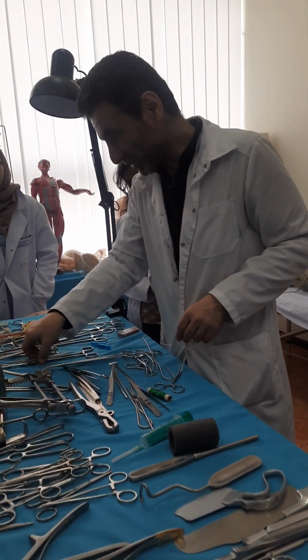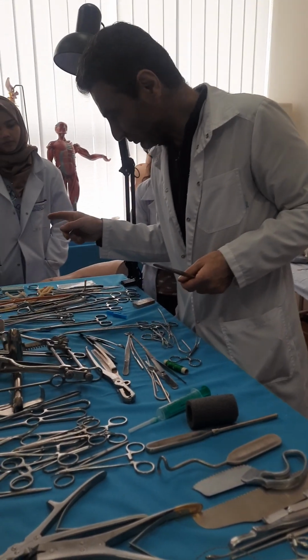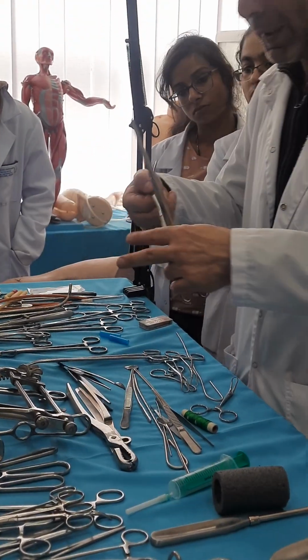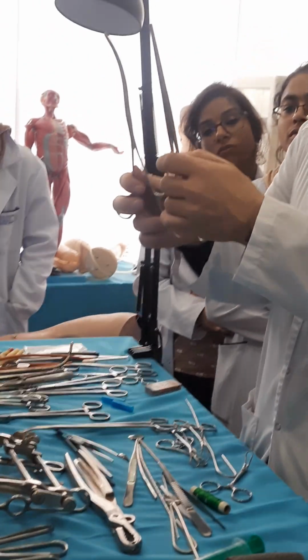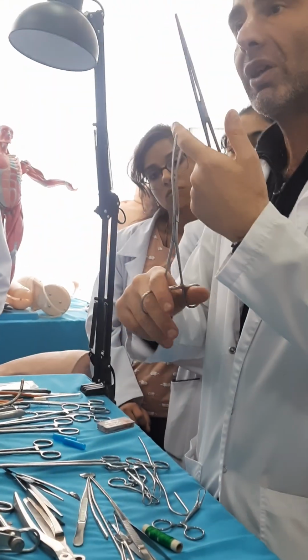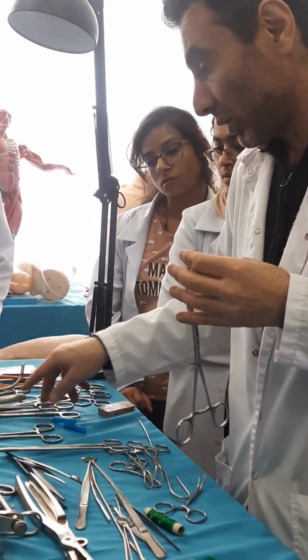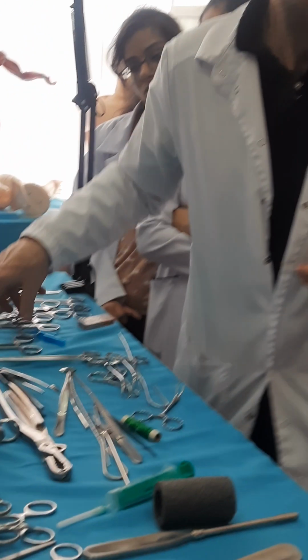Okay, let's continue. Now, I want to show you two instruments. Both we call intestinal clamps. But this one is occlusional, it doesn't crush the structure. This one is crushing. Traumatic.